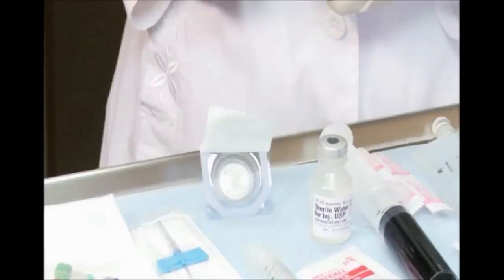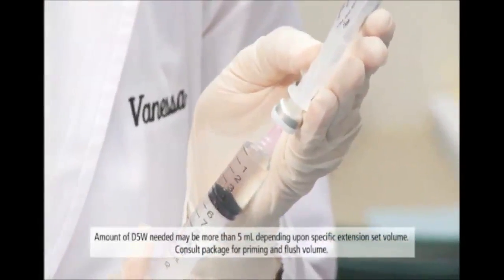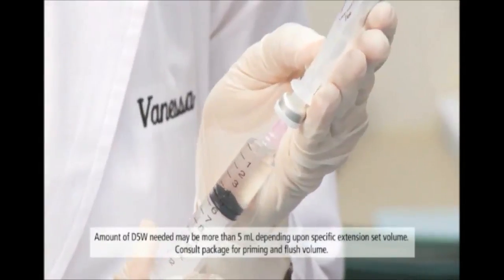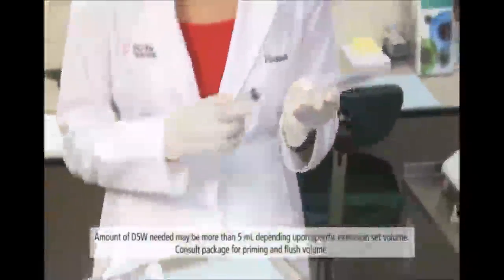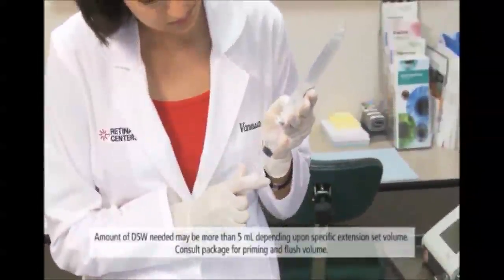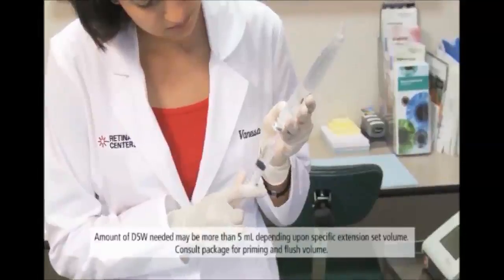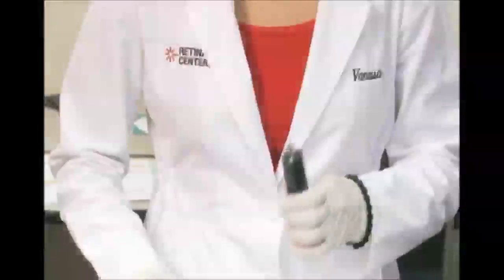The following procedure is a recommended approach. Withdraw 5 mL of D5W into each of two 10 to 20 mL syringes and set them aside. One will be used to check for blood return and patency before infusion. The other will be used to flush the remaining Visudyne at the end of the infusion process.